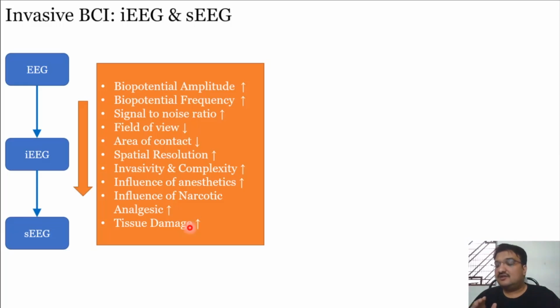But there are different kinds of anesthesia available. Suppose there is a case when you need to get an idea about the sensory system, you need to make sure that the subject is not losing any kind of sensory function during the surgery. So in some complex surgeries, you might have to check the functionality of the sensory system during the operation. For such intraoperative checks, there is a specific kind of anesthesia available which will suppress some of the functionality of your sensory system, while making sure that the rest remains intact.